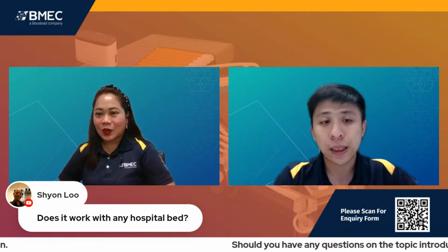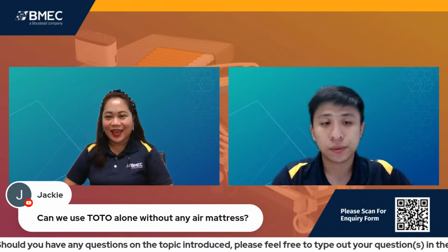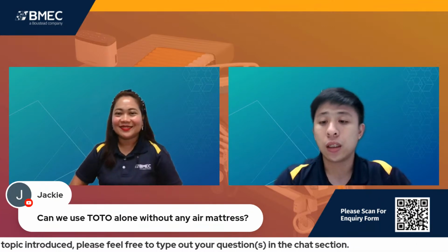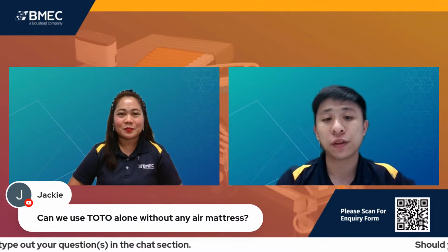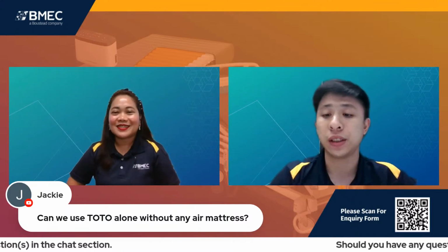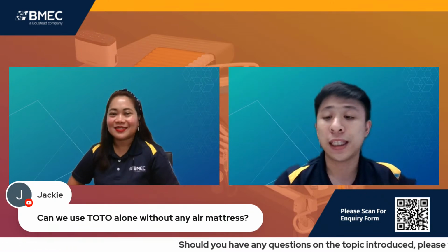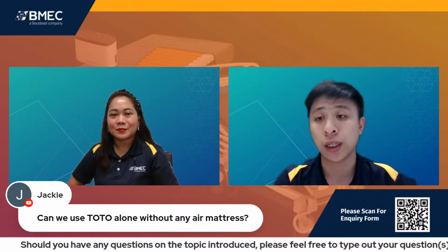Another question: can we use Toto alone without any mattress or air mattress? You can't use Toto by itself. It still has to be used together with a mattress on top. It doesn't necessarily have to be an air mattress; a general mattress would work as well.